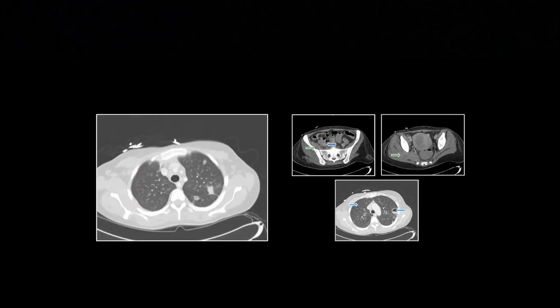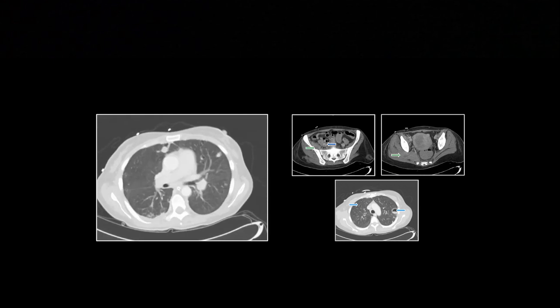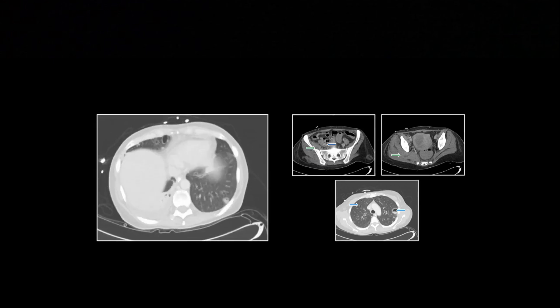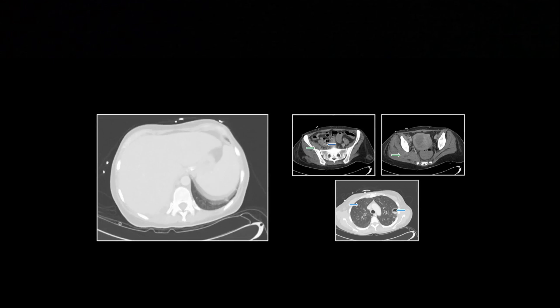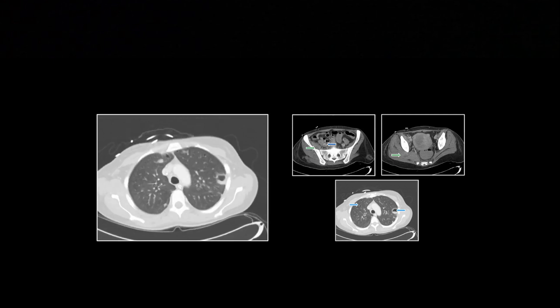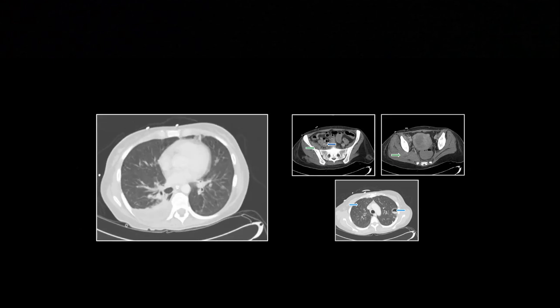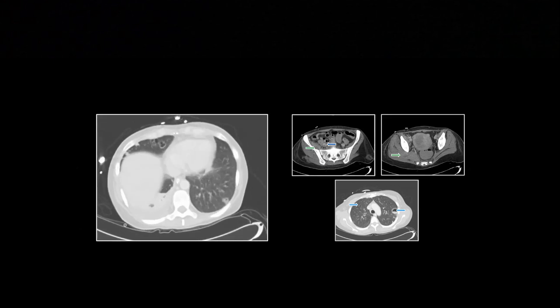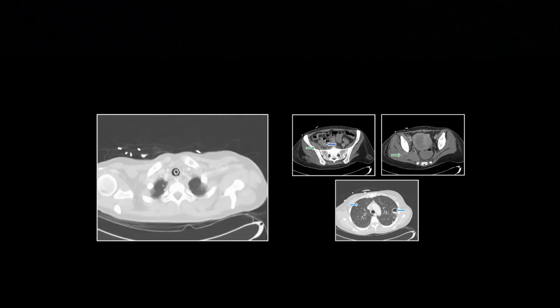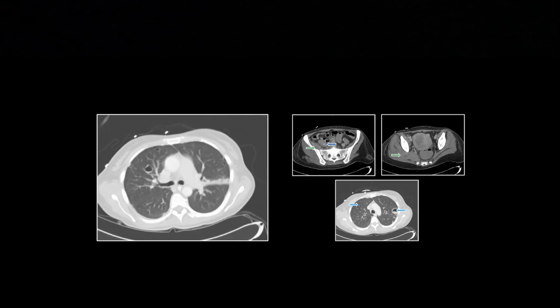Here is the whole chest — many of these cavities are peripheral, not all but many. Multiple bilateral subpleural cavities: septic embolization. There's a nice fluid level in that one big cavity which should draw your eye and suggests this is going to be infectious.